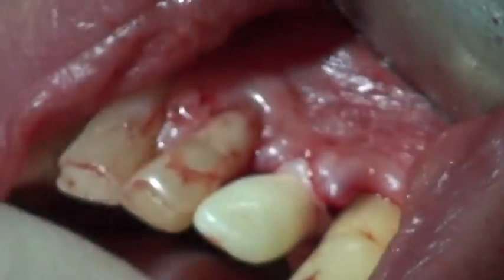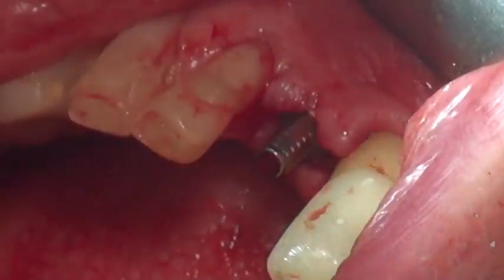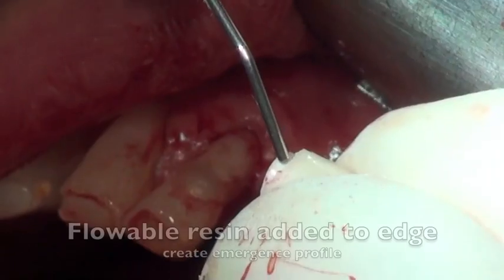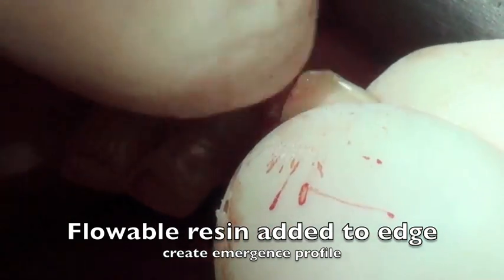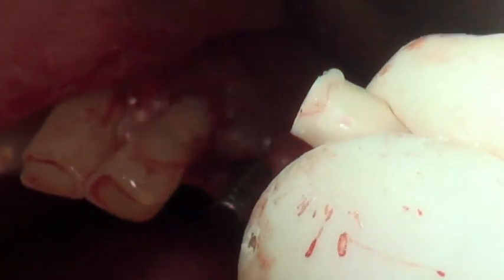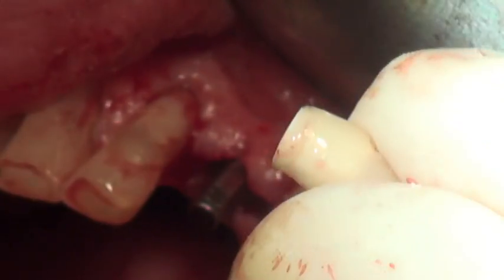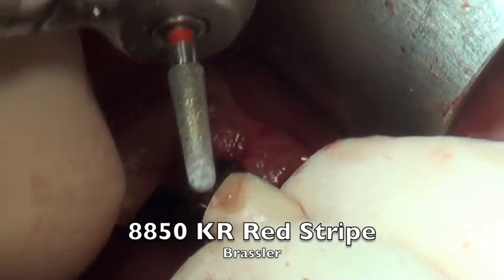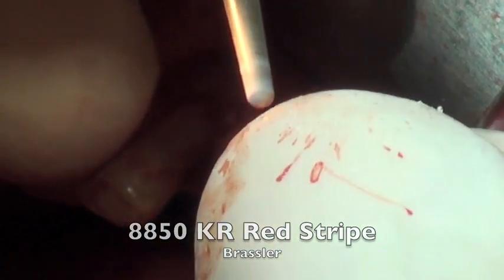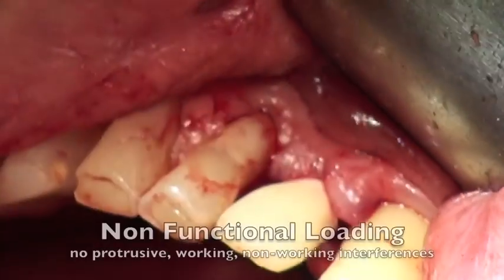Once the plastic crown form has been pulled off the outside of the new crown, we add flowable resin to the edge to create some emergence profile for the subgingival area — sometimes quite a bit of flowable resin is needed here. We light-cure this and then shape it with a diamond — I'm using an 8850KR Brassler diamond red stripe — to shape the area. Then you smooth it with sanding discs to get it fairly close.